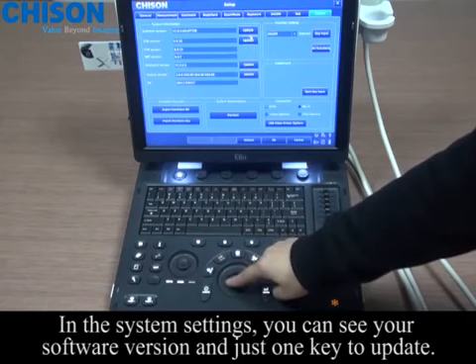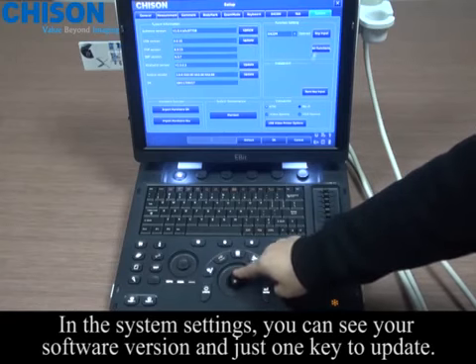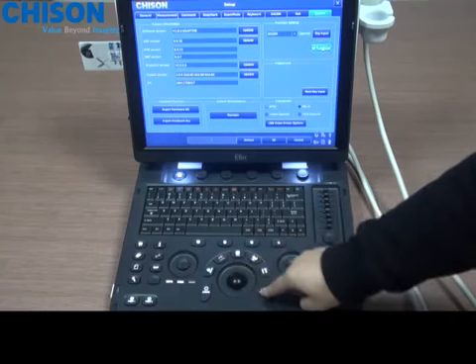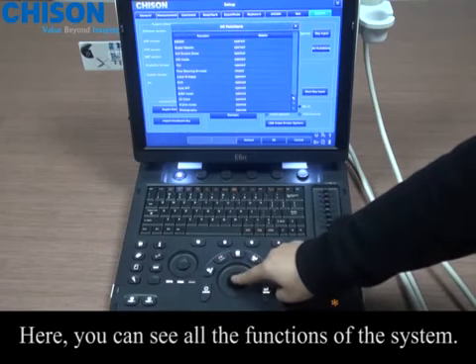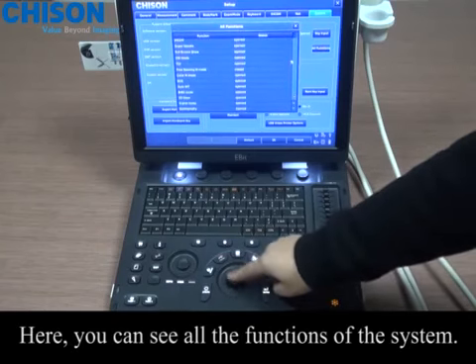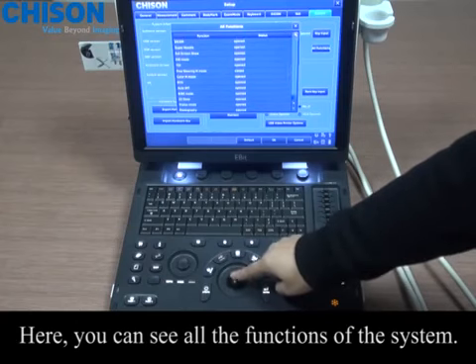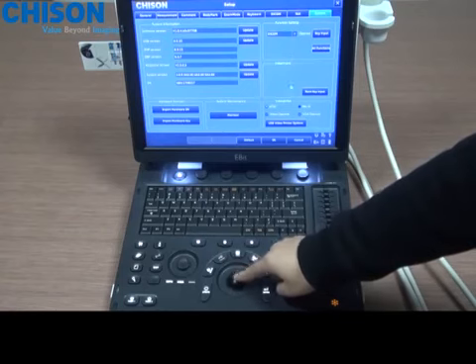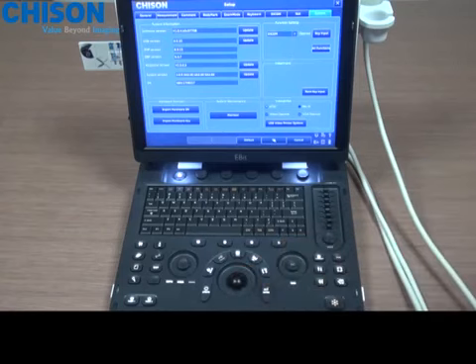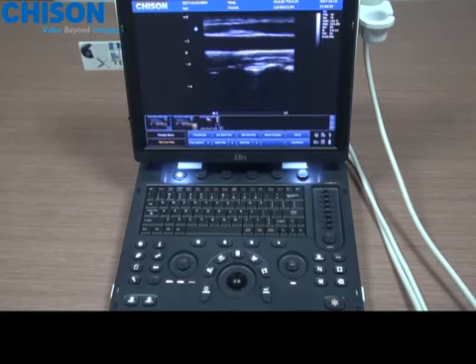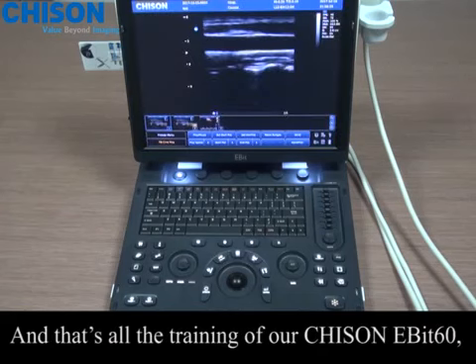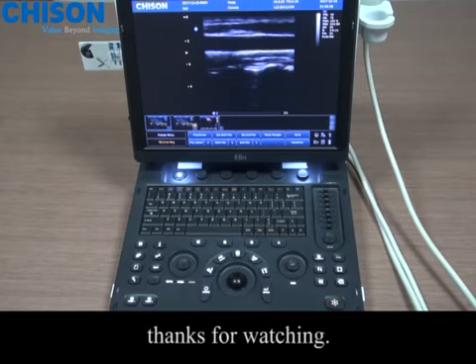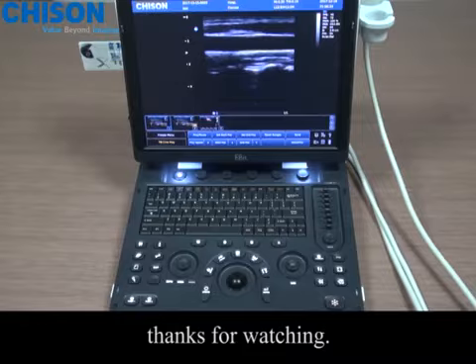In the system settings, you can see your software version and just one key to update. Here you can see all the functions of the system.